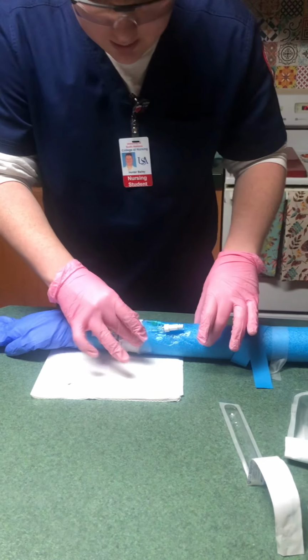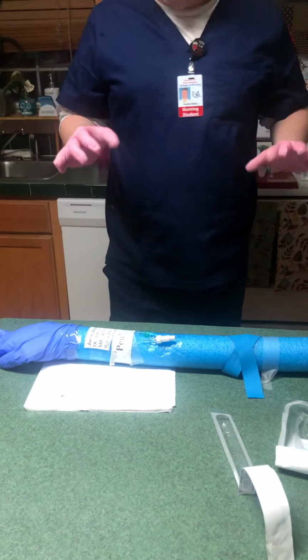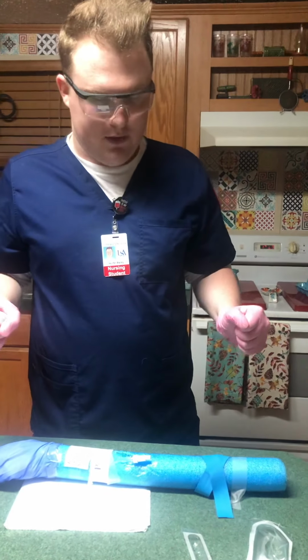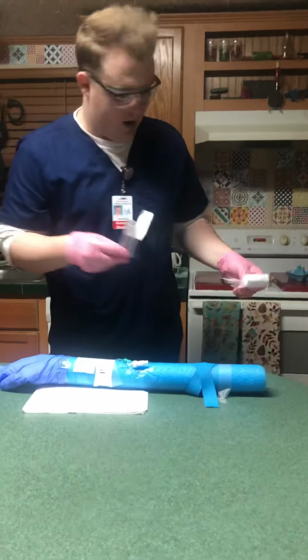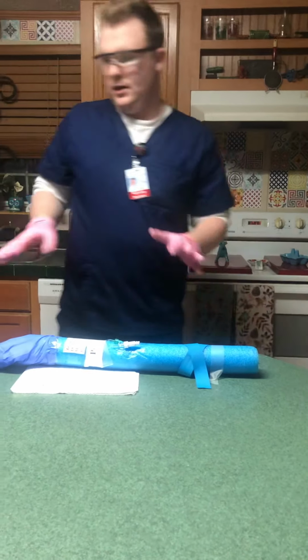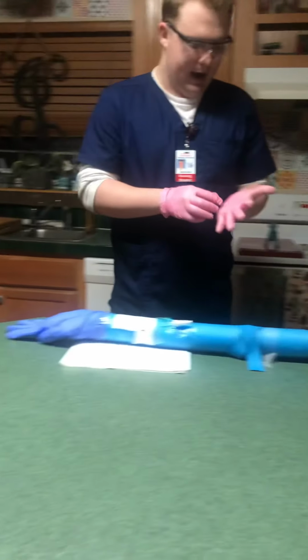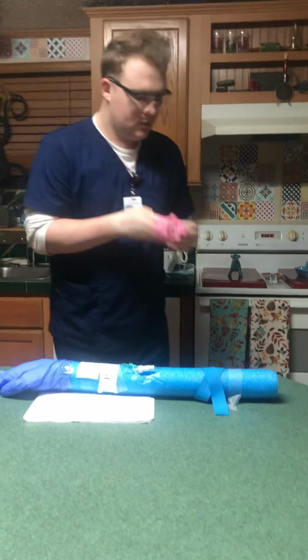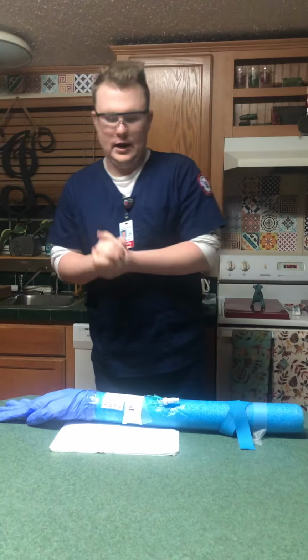Okay. Whew. So now after the final tape is over, I'm going to go ahead and clean up my mess. So I'm going to get my wrappers and clean up any additional mess that I have, and I'm going to take off my clean gloves and perform hand hygiene.